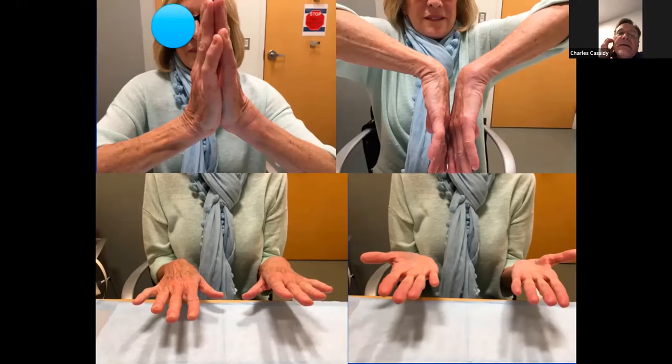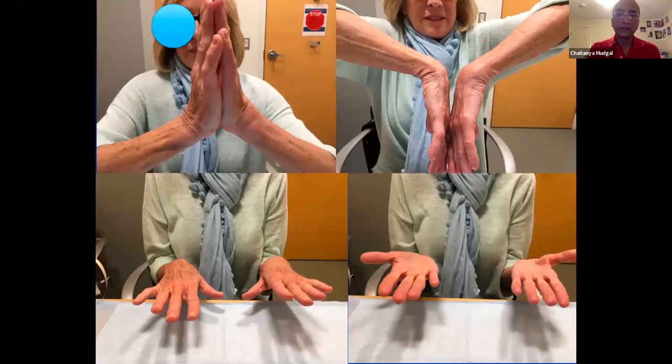I did one recently — it was a radial styloid fracture with a scapholunate gap, kind of upper limits of normal. I wasn't sure if the scapholunate ligament was really torn or not, and it worked out well because his ligament was intact, at least technically. I fixed the styloid just with some K-wires, arthroscopically assisted. We'll come to that in one of the later cases.